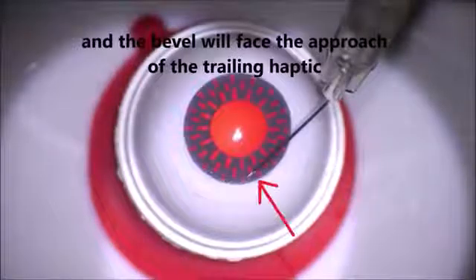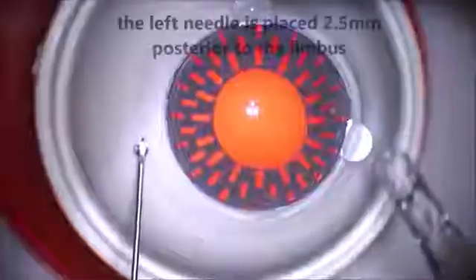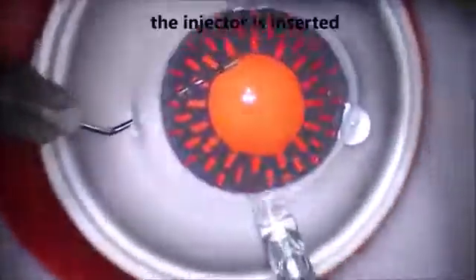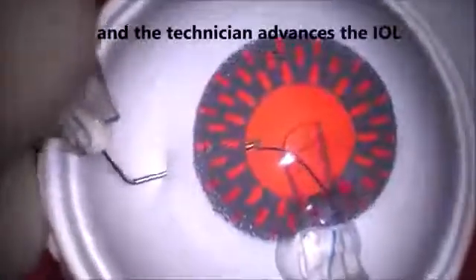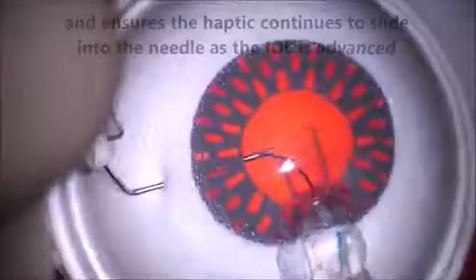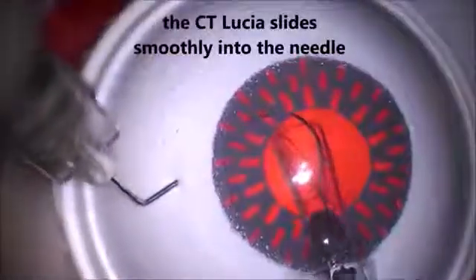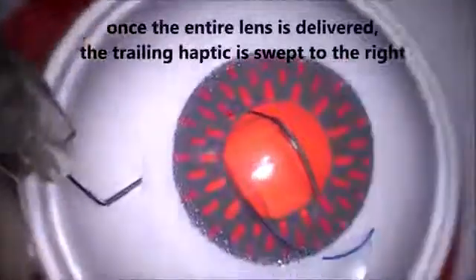You can't advance the haptic if it's curved. If it's not straight and parallel to the needle and facing the needle, it will not go in and you will damage the haptic. The bevel orientation is very important, and bending the needle in the correct direction is very important. Engage the bevel with the haptic, turn the haptic, flatten it out, then advance it. When externalizing both haptics, I like to do them one at a time — pull one out, cauterize it, then pull the other out and cauterize it.